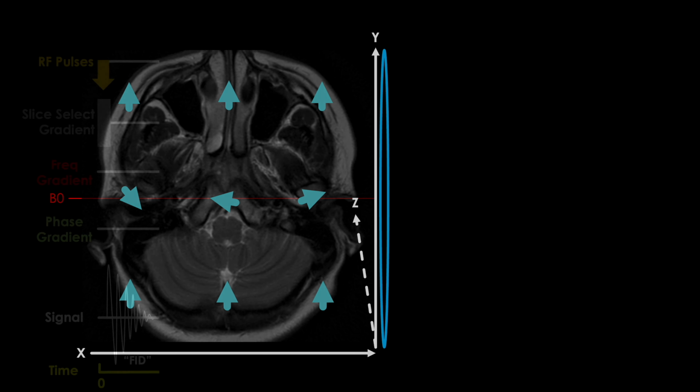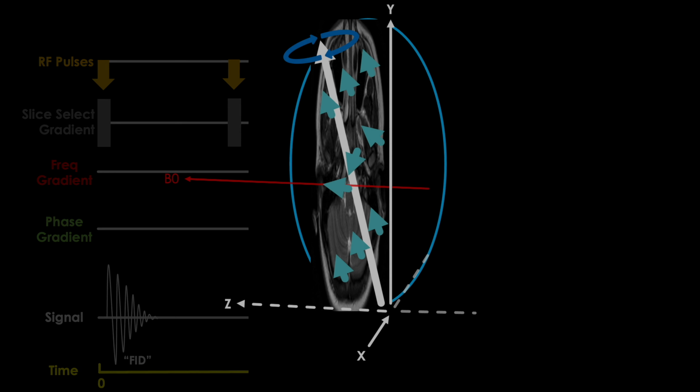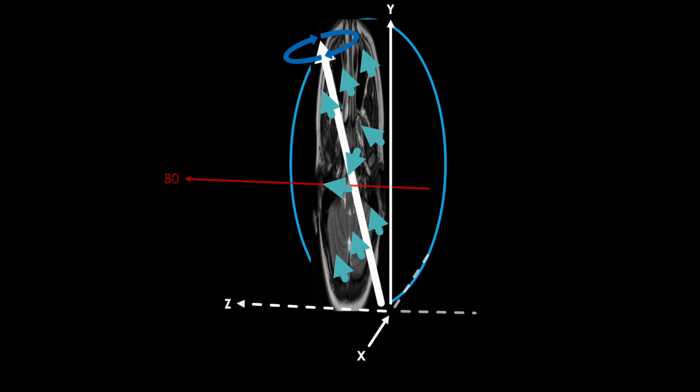So we're back to this point, and we'll once again try to apply another RF pulse, but something has to change as last time it did not result in an echo. So here we are. We've generated our free induction decay and slightly relaxed back towards the z-axis, with the overall orientation of these spins as shown by the white arrow.